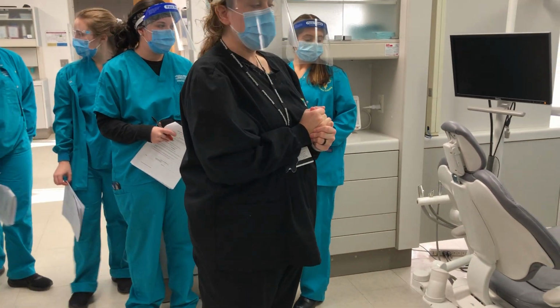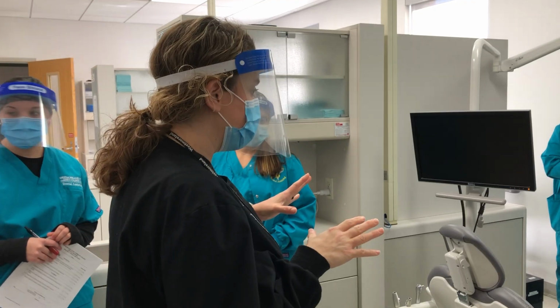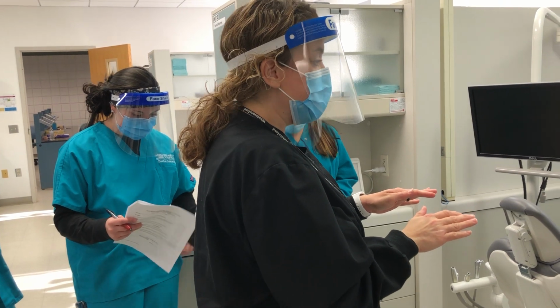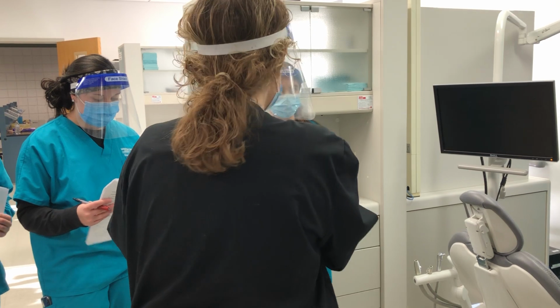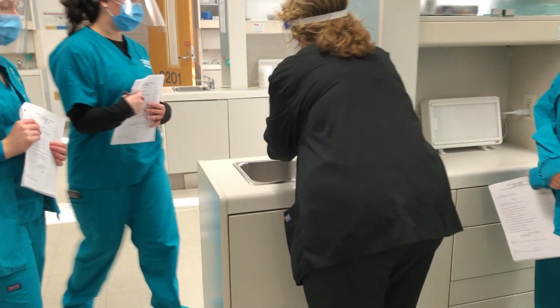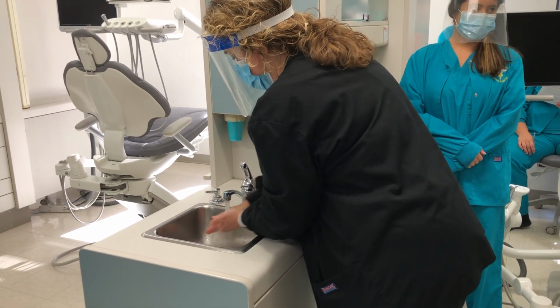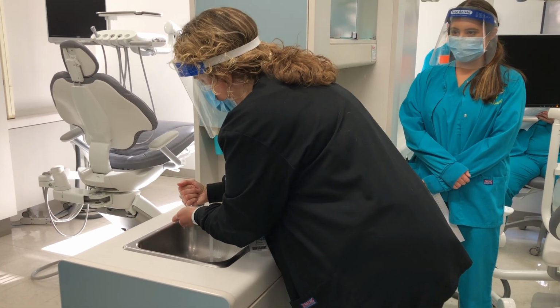Okay, so we are just basically thinking through this from start to finish. You would, at this point, still have your operator gloves on, because you just finished the procedure. So the first thing that you would do is take your operator gloves off and throw them away, and then wash your hands. So we're gonna come over here and do our antiseptic hand wash.